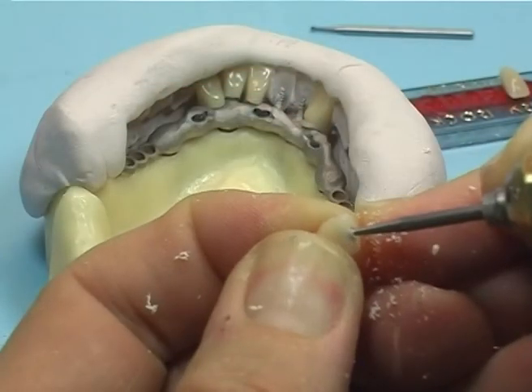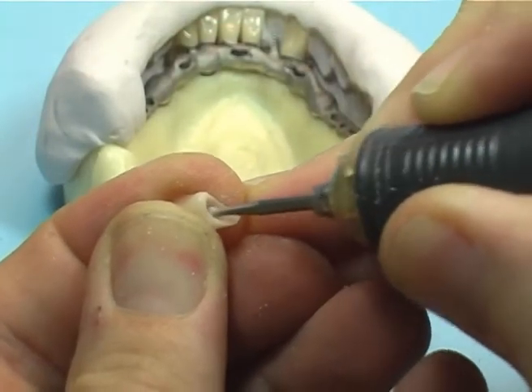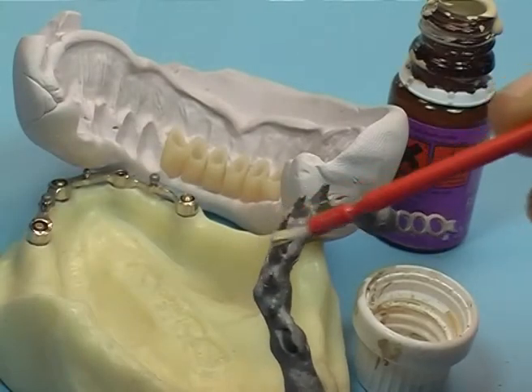Check dimensions using the trial mask and adjust any excess surface if necessary. Grind teeth to be adapted to their reinforcement pins. Make up metallic parts with appropriate enamels in order to color their appearance.